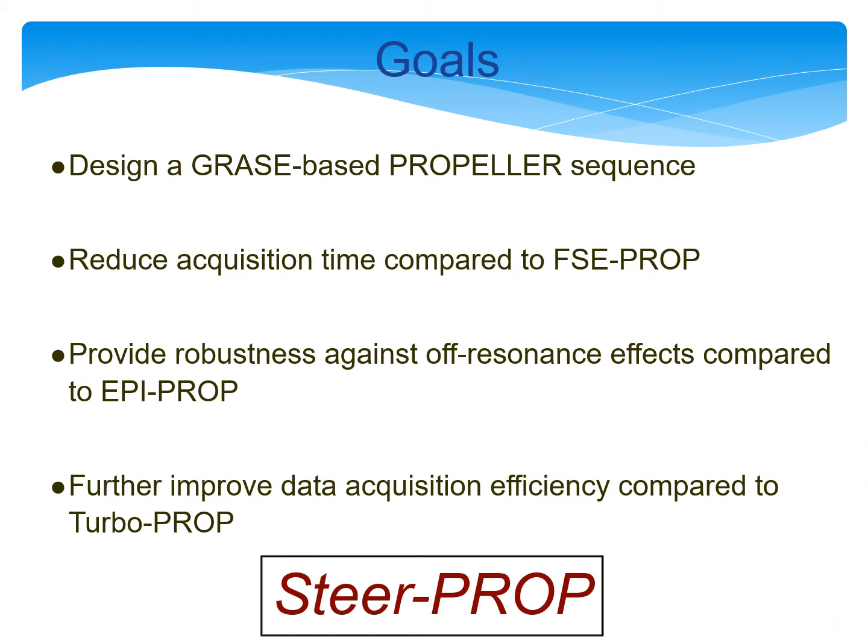The specific goals of our work were to design an alternative GRASE-based propeller sequence that reduced acquisition times compared to FSE propeller, provided robustness against off-resonance effects compared to EPI propeller, and further improved the data acquisition efficiency compared to Turboprop. And this is what we created as SteerProp.